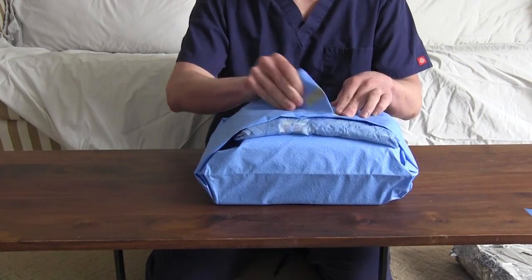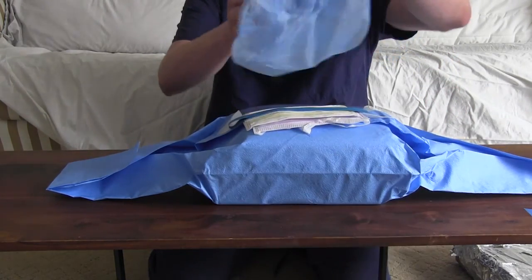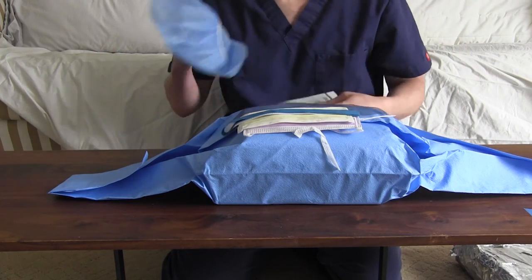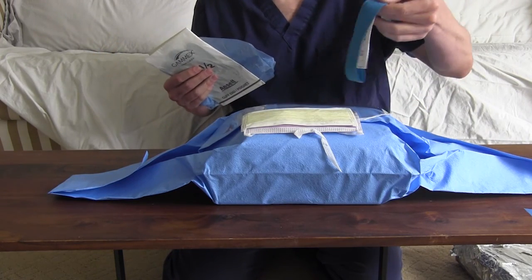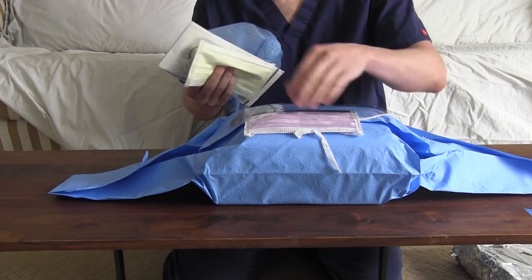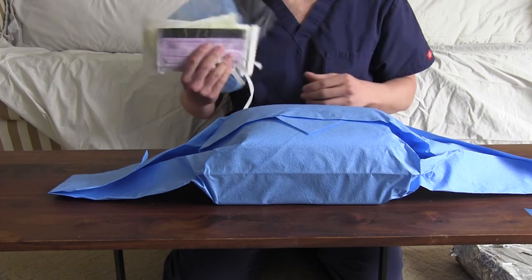Okay, let's open this bad boy up. So right up top, you got your hat. You got a set of sterile gloves, and you have a tourniquet and a tape measure. You also have a mask for your assistant, because they should be wearing a mask throughout this procedure as well, because it's full sterile.